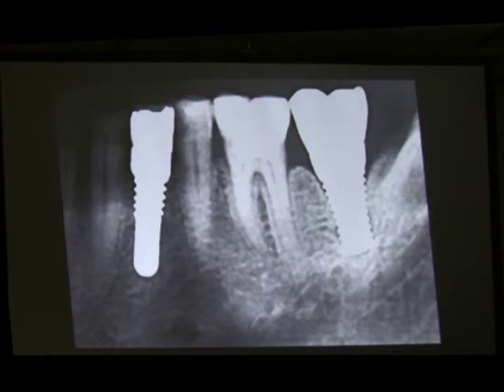So the difference is that when you do this all the time, you always know that the gum went as apical, as more incisal as possible, and we tend to have fewer interventions of soft tissue augmentation 4 months, 5 months after, because we let the gum go on its own. So the advantage of doing this is... I see what your advantage is as well, but there's some question as to whether or not you can do it. Yeah. But you can do it, but it is technique sensitive.